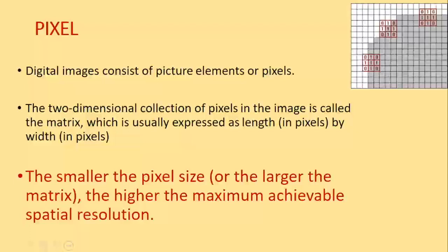All of you, I'm sure by now, know what a pixel is, just a picture element. It's a digital image, one small element of a picture. What's important here, for you to have that great spatial resolution, you should have small, tiny pixels. The smaller the pixel, wonderful for us. But these pixels should be on a wide array, a big matrix. So this matrix should have like 1056 by 1056, or as many pixels as you want. The more you have, the better the spatial resolution.